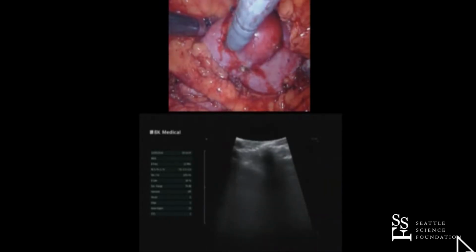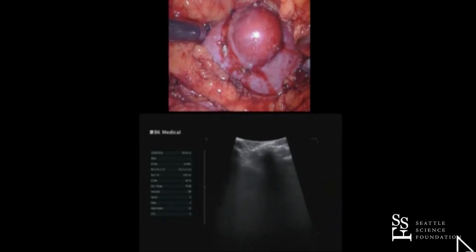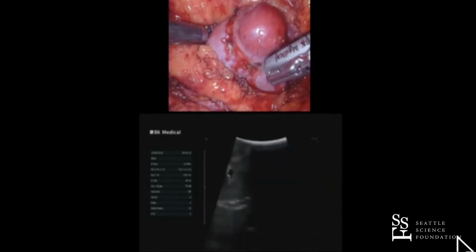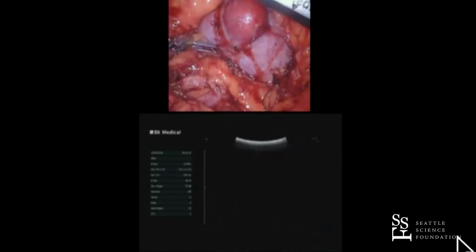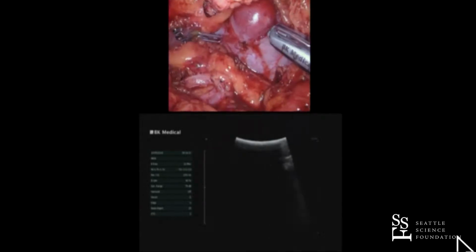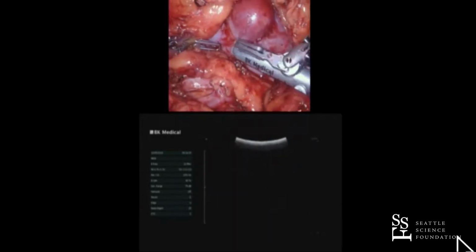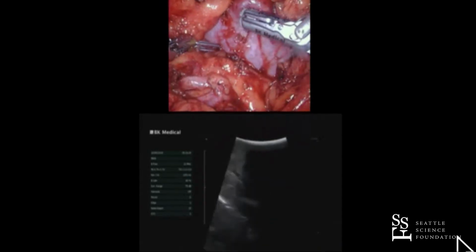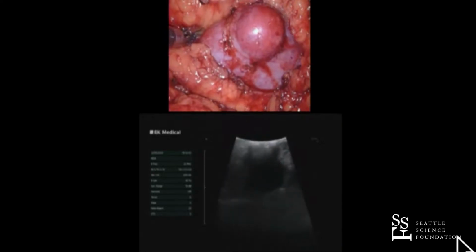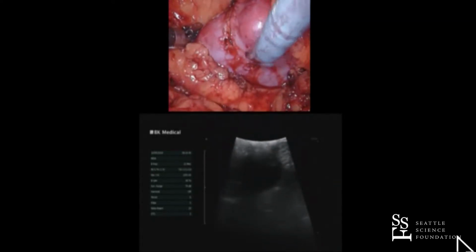When I was at OSU, it was interesting. Our GU pathologist did an interesting study. She looked at these tumors that we had taken out, and she looked at the kidney tissue around the tumor. And for the first 5-6 millimeters of kidney, it's useless anyway. It's all hyalinized, there's no glomeruli still there, it's all been crushed by the tumor growth. So I don't see really why you're enucleating. Maybe it's less bleeding is why people do it, but really you're not saving functional kidney anyway. So just get a grossly negative margin.